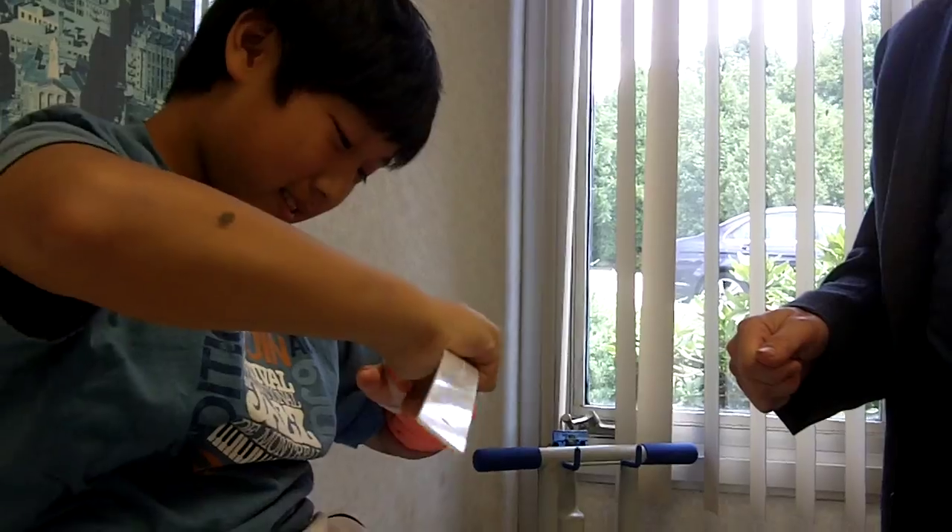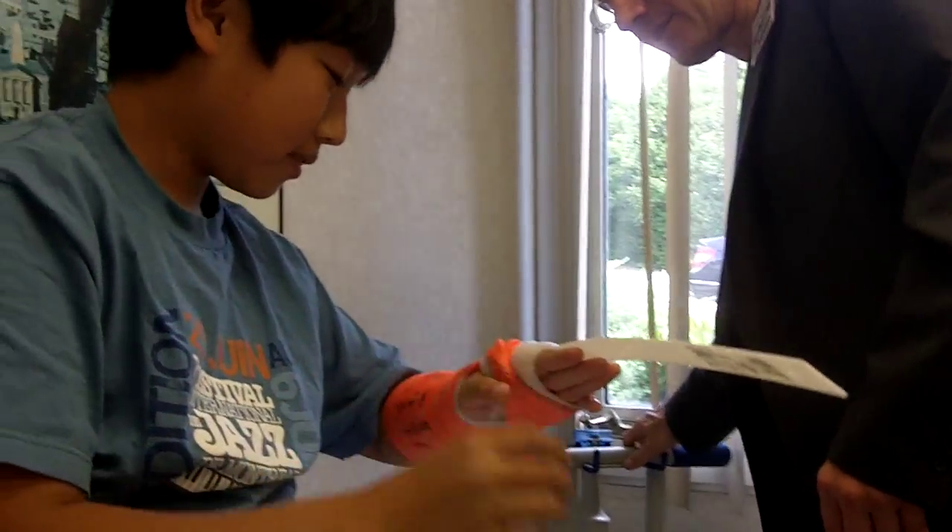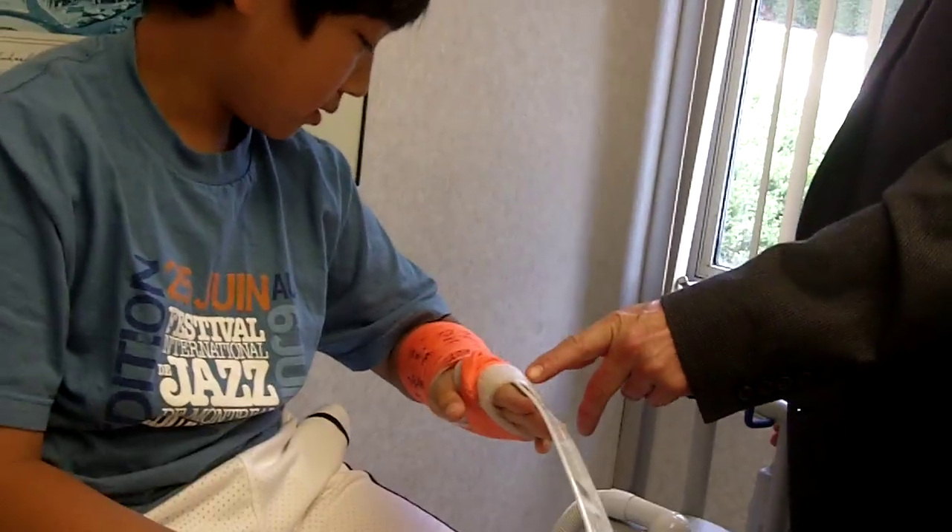It may not work, but it has to be working. Okay, that's good enough. Alright, so what we're going to do — we'll start here and then I'll probably have a direction.